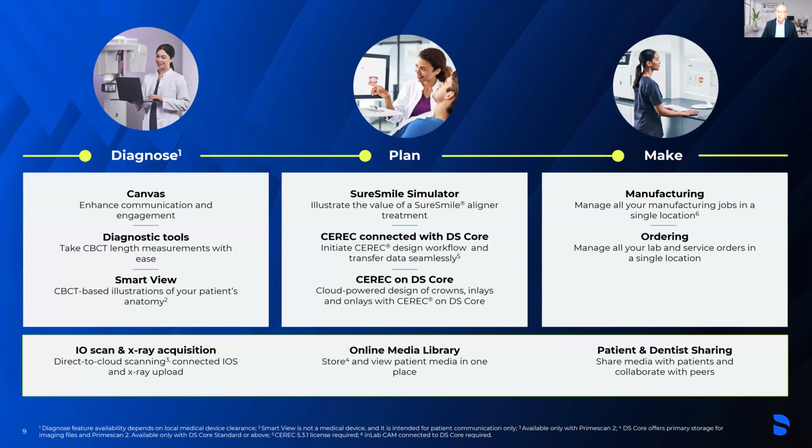So diagnosing, we have a Canvas feature. So it's an enhanced communication for your patients. Diagnostic tool abilities with CBCT length measurements being brought into DS Core, as well as Smart View. So you can do illustrations within DS Core directly through the cloud software. So you're not tied to just a specific planning software with CBCT anymore.